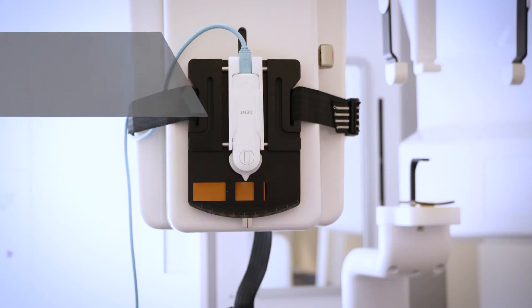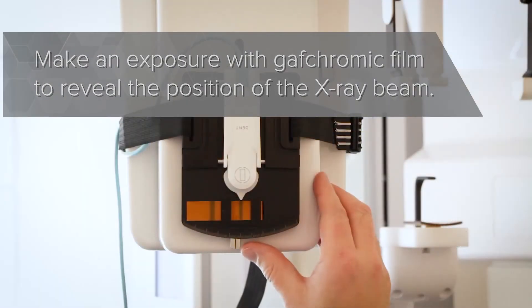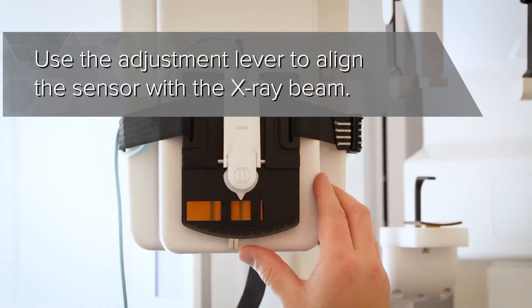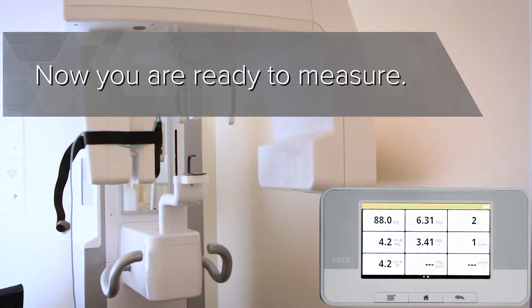Make an exposure with gafchromic film to reveal the position of the X-ray beam. Use the adjustment lever to align the sensor with the X-ray beam. Now you are ready to measure.